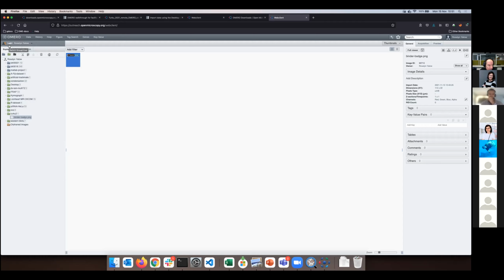So every day when you're coming to your institution in Turku, then you open a computer, you certainly have to log in, and that login name and password is stored somewhere. So Omero can connect to this store and harvest the passwords there. I'm sure that almost certainly you will do that like that, but if not, it doesn't matter. It will somehow get your username and password, and it will be reasonable.